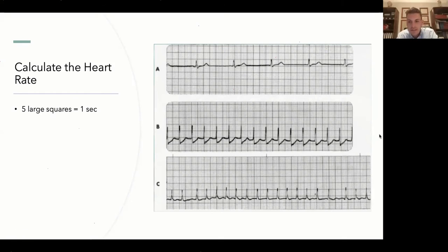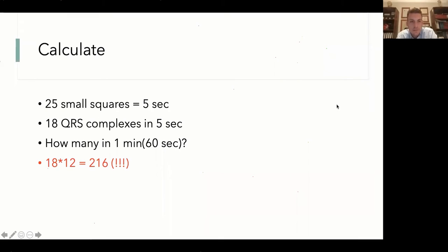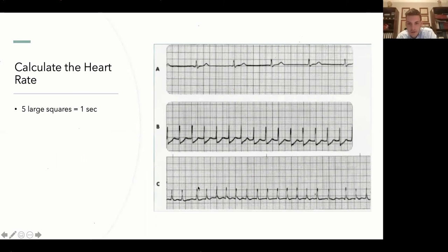And last but not least, let's talk about C. Is C regular or irregular? That is irregular, that's correct. And yes, let's go through it and explain why, shall we? As you can see here, it's irregular. So we need 5 seconds of time, and in those 5 seconds you need to multiply by 12 to know the number of beats occurring in 1 minute, okay?